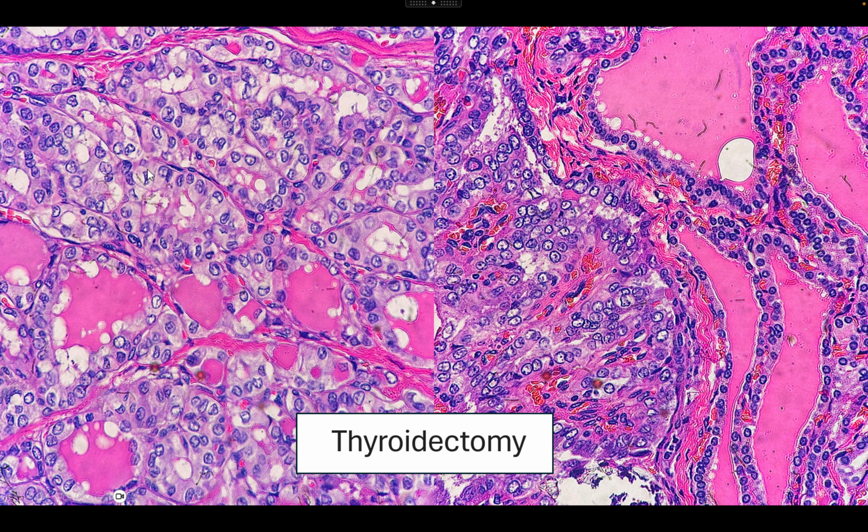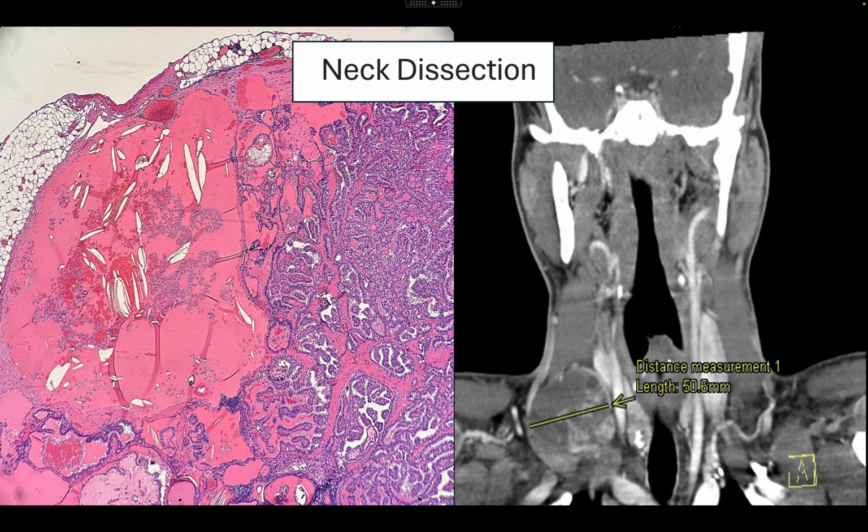I'm just illustrating how tricky these can be, though, because they don't have any inclusions, they don't have any nuclear grooves, they are enlarged. Here's a picture of an adjacent normal thyroid follicle, and how large these neoplastic thyroid cells are compared to these ones. The cells are vesicular, they're enlarged, they have pinpoint nucleoli, but again, no inclusions or nuclear grooves.